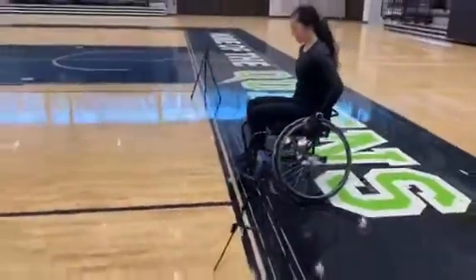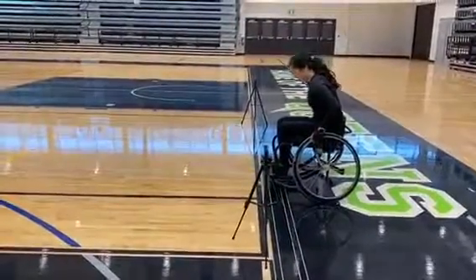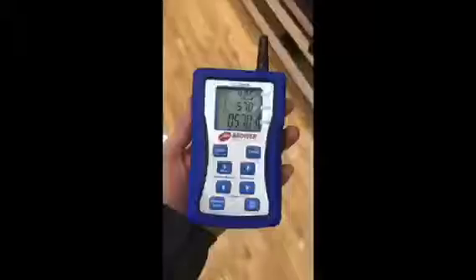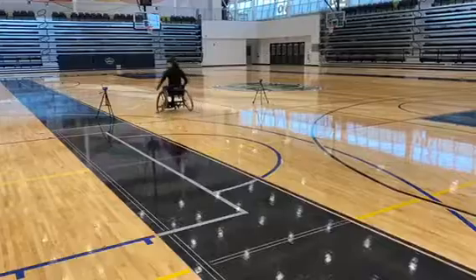Once you are lined up, the administrator will ask you if you are ready to begin, and if you are, they will instruct you to start. The participant then will try and propel as fast as they can to the finish line. Each participant will undergo 3 trials to try and get their best time.